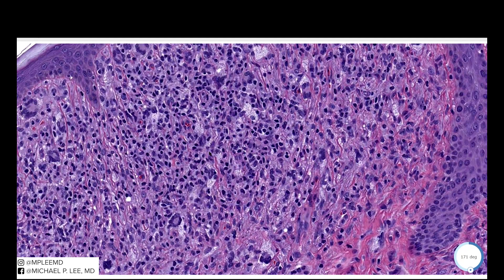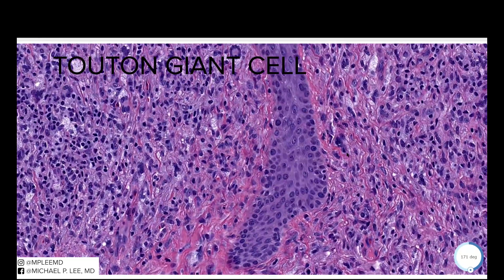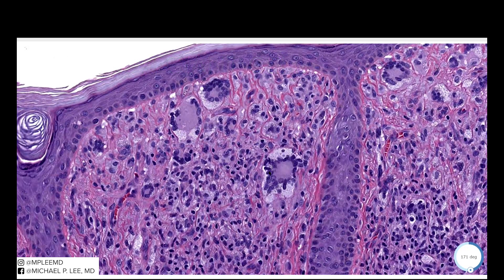We have a mixture of lymphocytes and foamy macrophages, and scattered around are also macrophages within tissue that have taken on a giant cell form. These are called Touton giant cells. Coming up to the upper portion here, you can see that Touton giant cell is really pronounced — it almost looks like a spider eye with a wreath of nuclei.